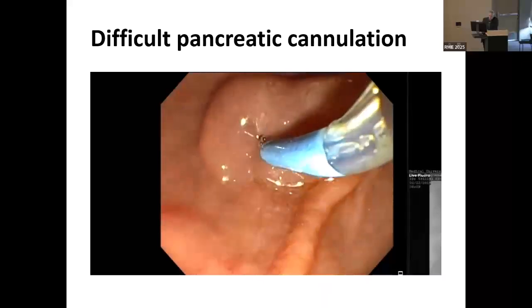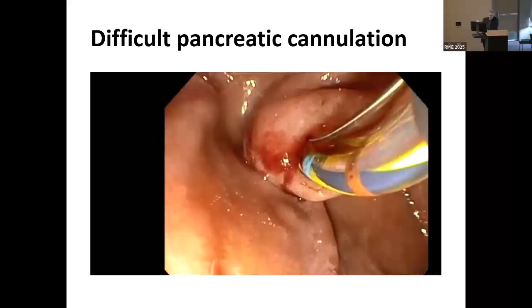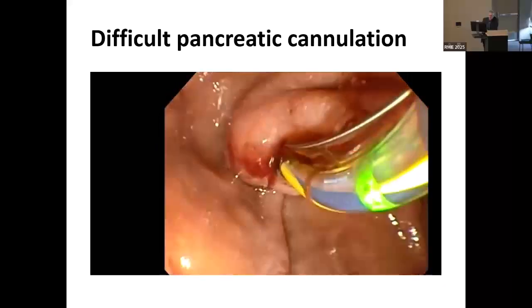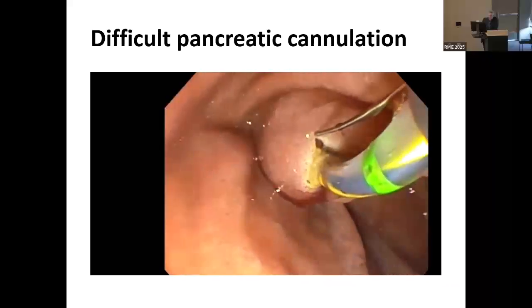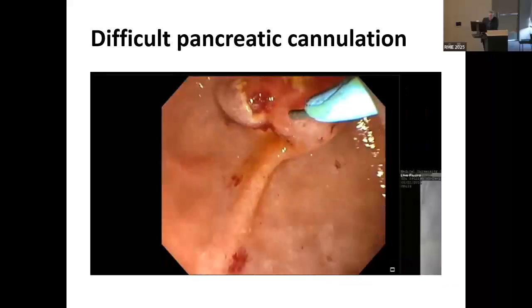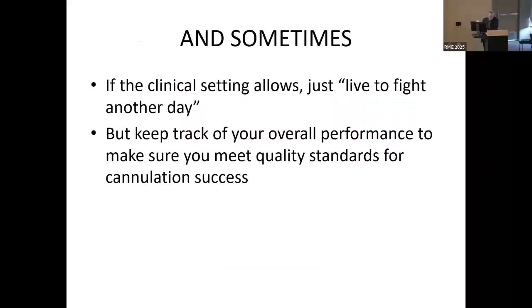And so you can see that the bile duct has been stabilized at this point. And then by repeated attempts, you can actually go ahead and get selective cannulation. A small pre-cut is done over here, and eventually getting in through it.